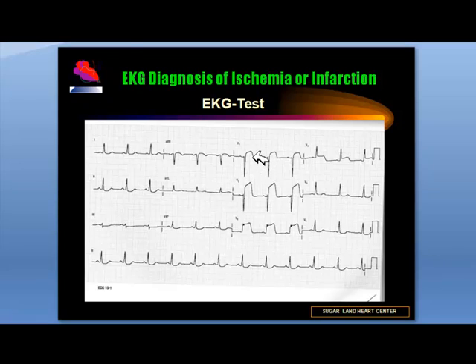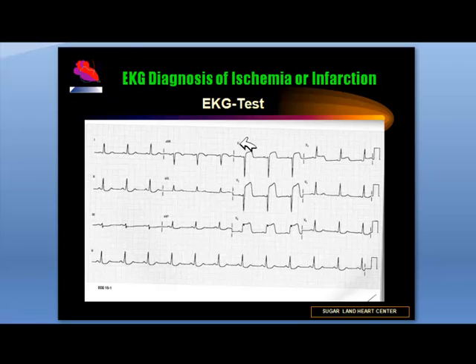As you can see in leads V1, V2, V3, and V4, there is significant ST elevation from the baseline. The T wave is lifted upwards, suggesting the hyperacute phase of an acute anteroseptal myocardial infarction. When leads V1 to V4 are involved, it represents anteroseptal myocardial infarction, related to occlusion of the proximal left anterior descending artery. There are tiny R waves, suggesting no development of Q waves at this present time.